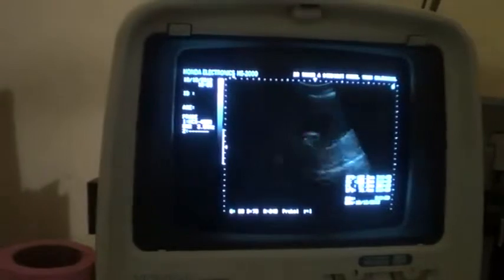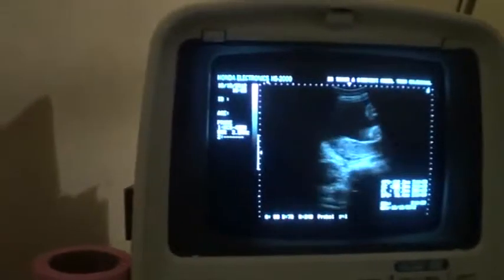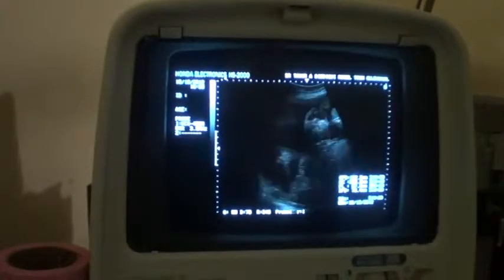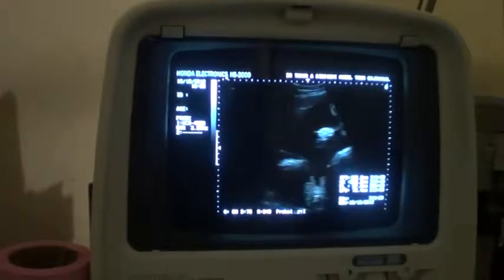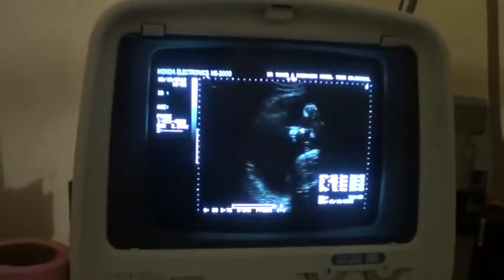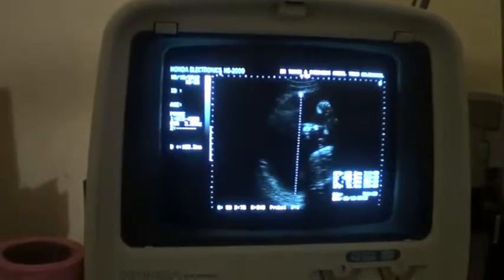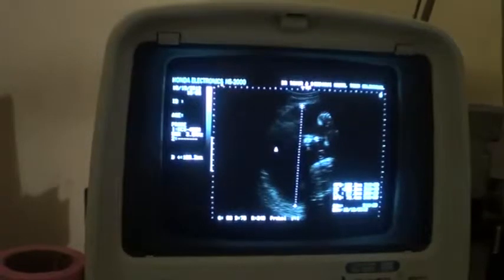Low-lying placenta, posterior wall, with a hyperactive fetus that you will see with the passage of time, as I will show you later on. But first of all, let's see how much the largest amniotic fluid pocket measures, excluding the umbilical vein. Now you see it measures 18.8. This is the amniotic fluid pocket.